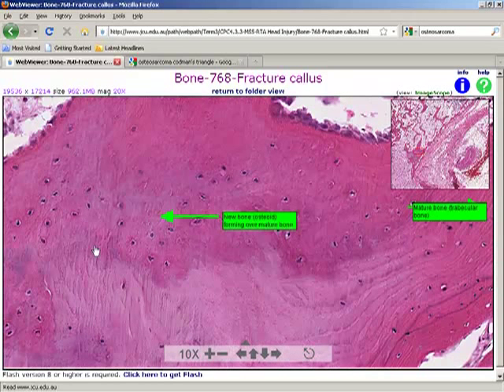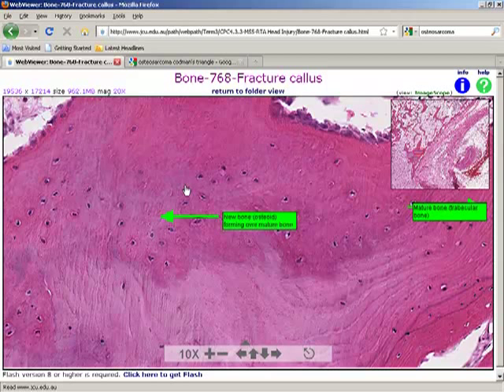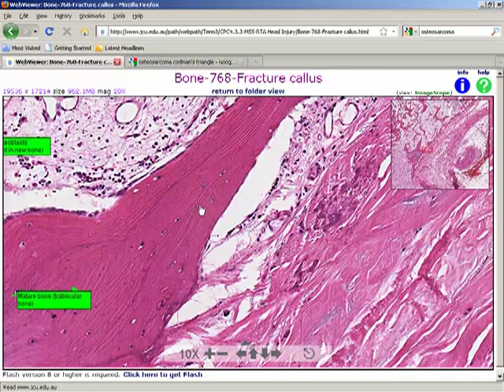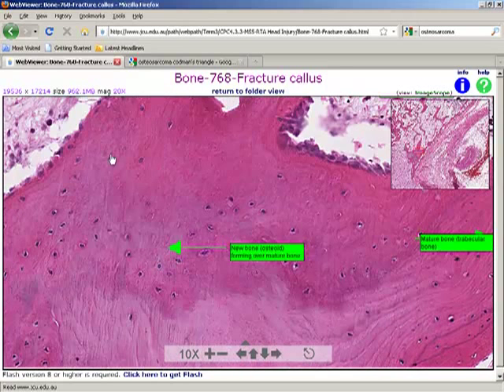And this bone which is without these lines, irregular, no fine lines, and osteoblasts prominent, scattered here and there, not like here along the lines, Haversian systems. This is woven bone, new bone, woven bone.